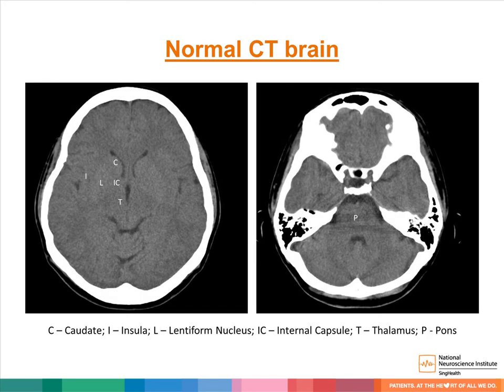This slide shows the normal appearance of a CT brain at the level of the basal ganglia on your left and at the level of the cerebellum on your right. Soft tissue appears grey, with the white matter appearing slightly darker than the grey matter. CSF appears black. Bone and calcification appear white.